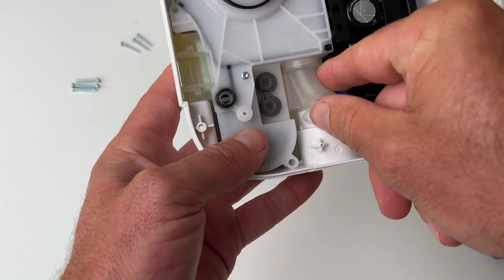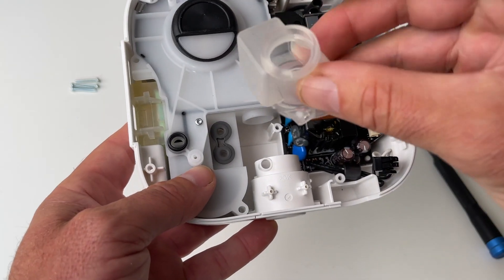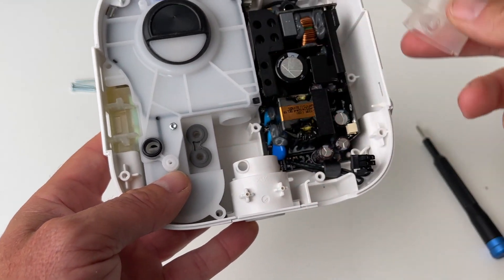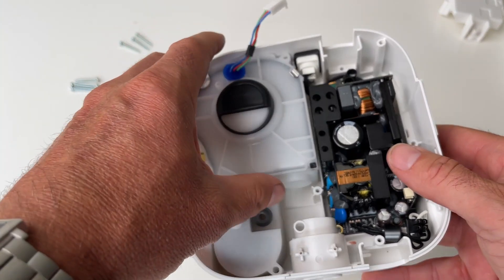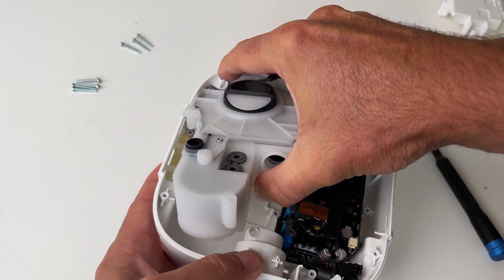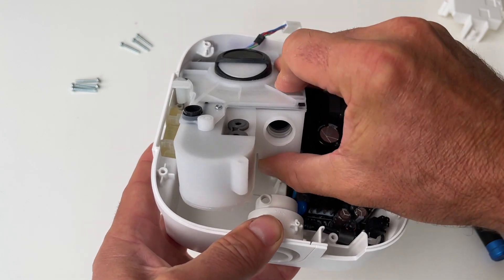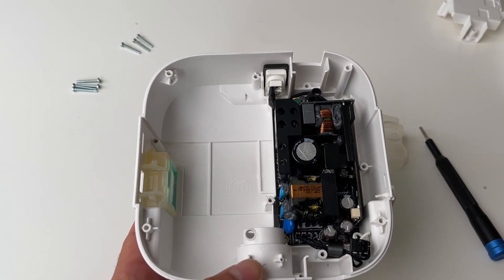Now we need to just remove this little plastic part — it pours off, easy to put back on — but I remove it because it makes it a bit easier to pull out the casing. So what we do now is get our thumb in, sort of lift up like that, and then pull it out like so. Just put that over to the side for now.